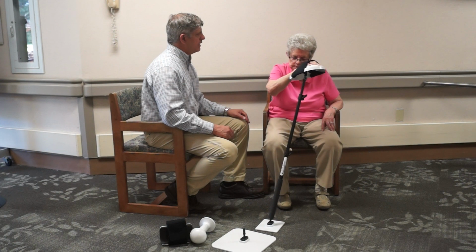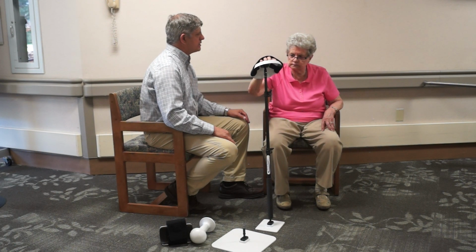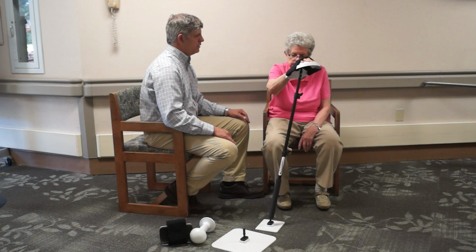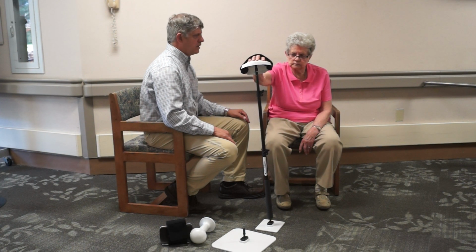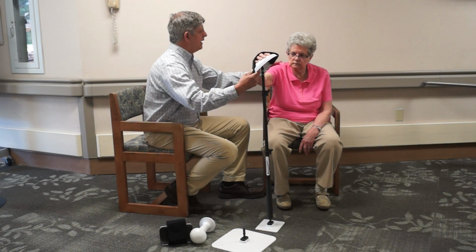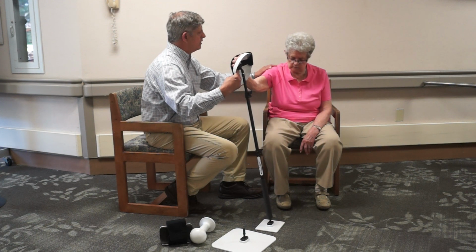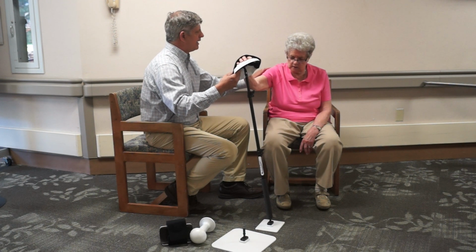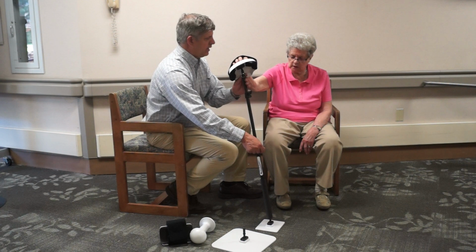And that's good. Keep your eyes on the target. That way your whole body's invested in the motion. And just try a few with your thumb up. That changes the dynamics of your shoulder when you end with your thumb up, okay? There. You feel how that kind of opens you up? Yeah. You can breathe easier. Okay? All right, let's take a break.